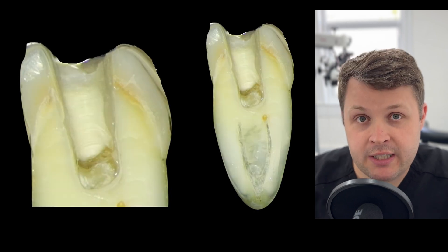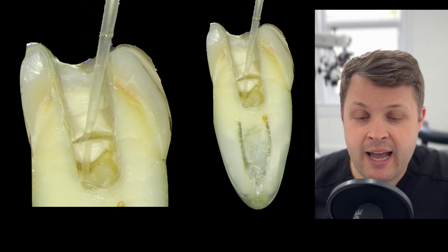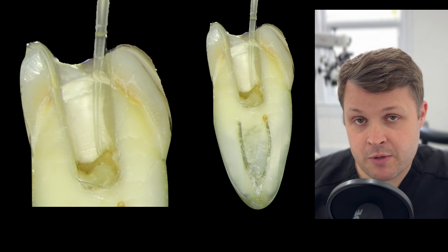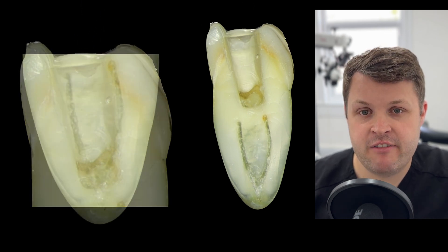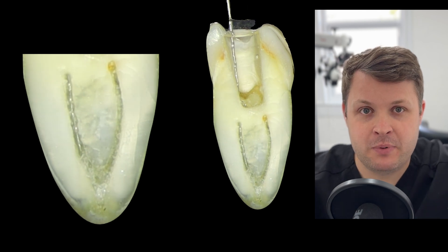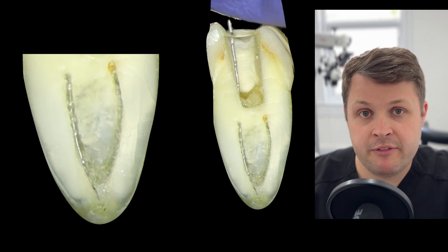The first thing to mention is that you must irrigate. I'm using side-venting needles with sodium hypochlorite — there are no other alternatives. I like to fill the irrigant all the way up to the top to get that bathtub effect. Once we've accessed the tooth and found the two canal orifices, we're going to try and negotiate them.